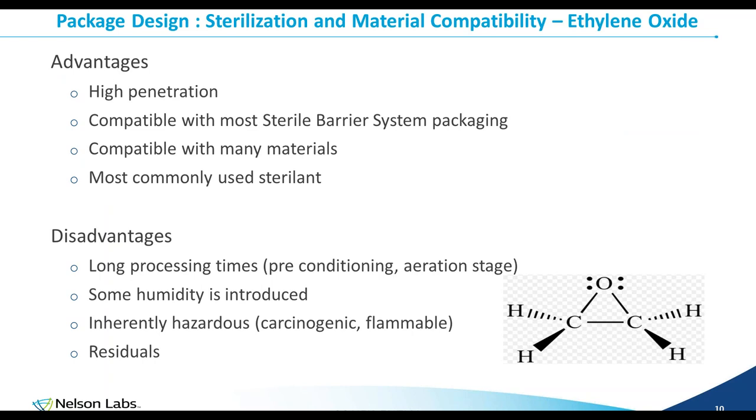Let's start with ethylene oxide. The advantages are high penetration. It is compatible with pretty much most sterile barrier systems. It is compatible with many materials, and it is the most commonly used sterilization method out there.